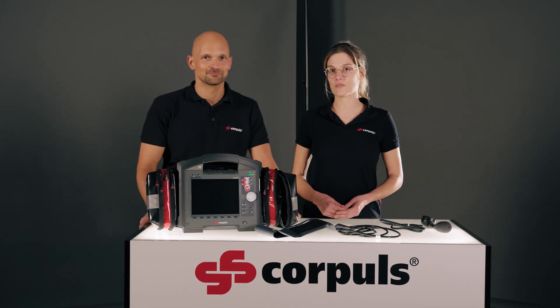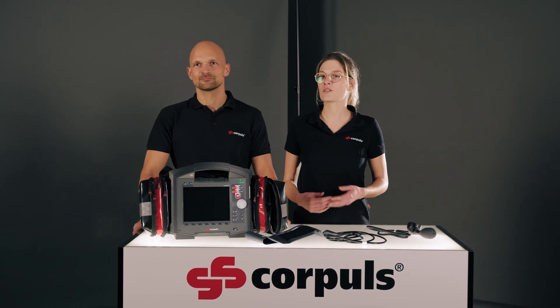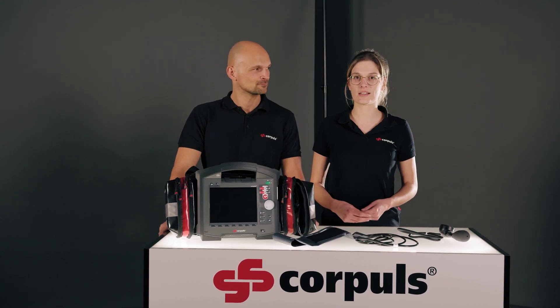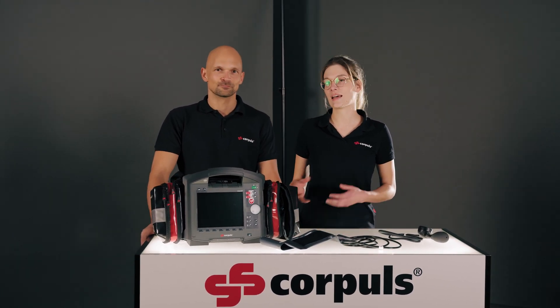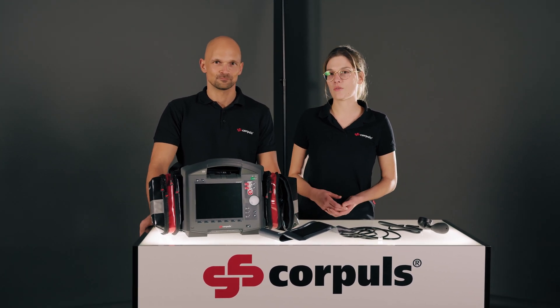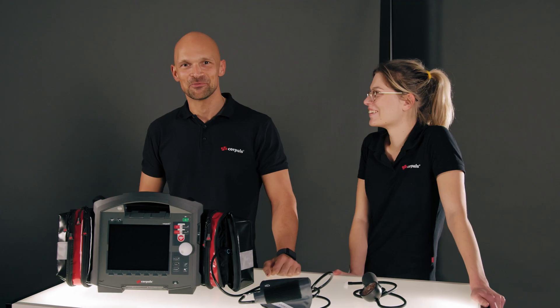In this video we look at non-invasive blood pressure measurement. First of all, we'd like to establish the basic requirements that we need to carry out a reliable measurement. We will then show you how it works, and at the end we will also go into a little more detail about the extra features that we have in the Corpulse 3T.